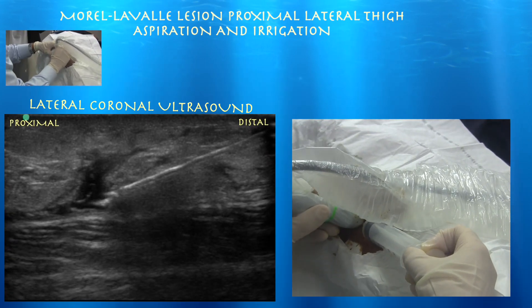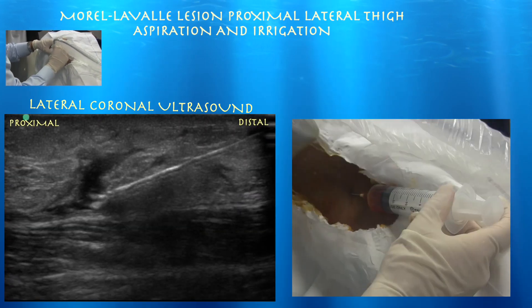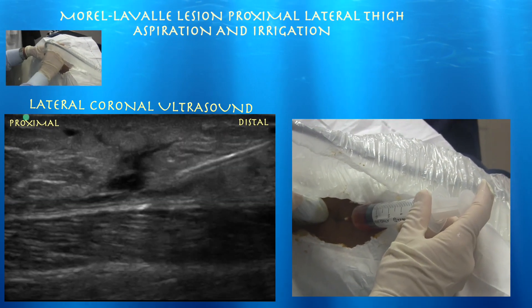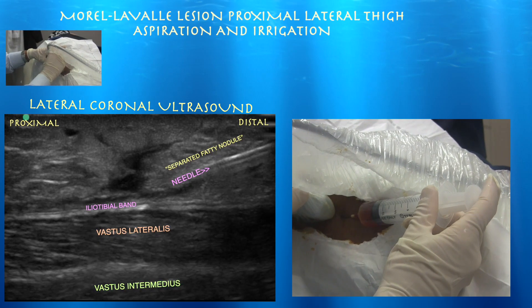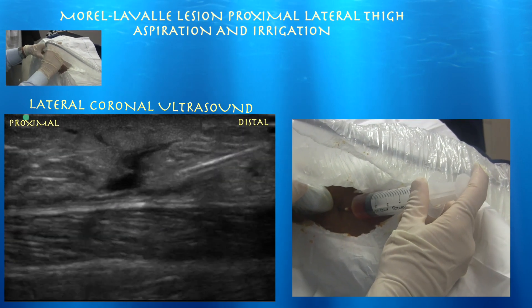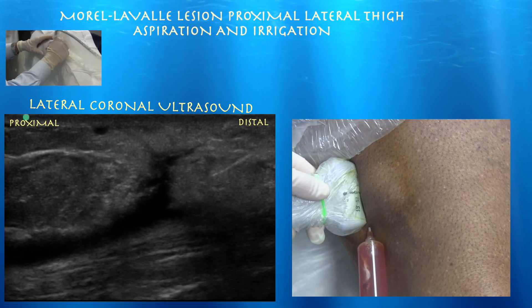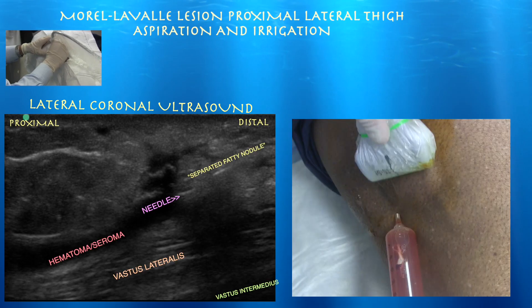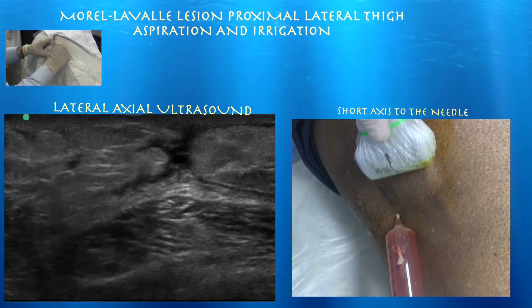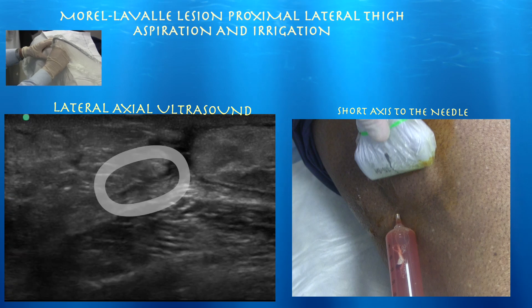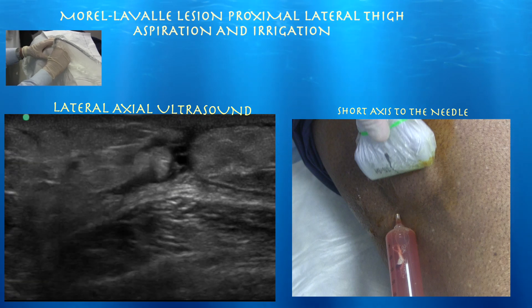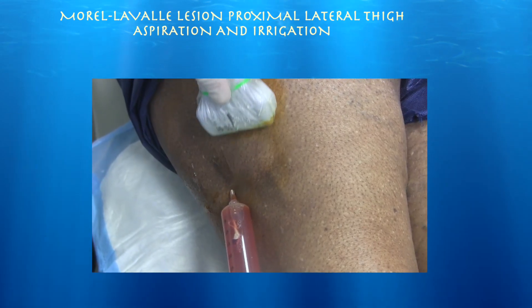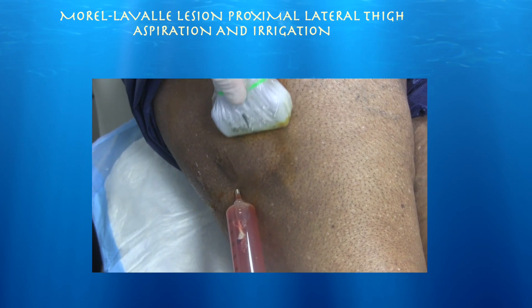This is round number three. Most of the fluid is still gone — only about 10 to 15 percent came back. Here's where ultrasound really comes in handy: we're threading the needle up the residual fluid stream, going proximal to the hard adipose nodules. This scarring is from the subcutaneous fat layer being sheared off the muscle, with fatty tissue that sloughed off the fascia and balled up.